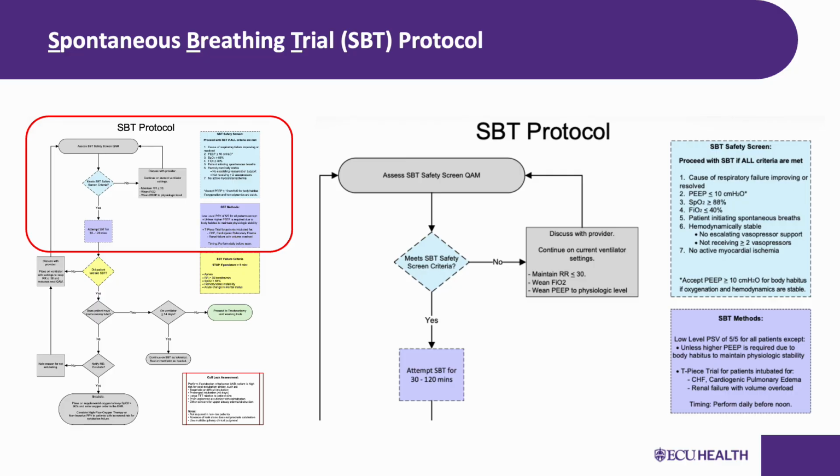The parameters emerged in the late 70s as an attempt to predict weaning readiness, but decades of research have shown us that they are poor positive predictors. The SBT replaced the approach with a direct functional assessment of the patient's ability to breathe independently. Bottom line, if a physician requests parameters, absolutely perform them. But our protocol does not require them because the evidence does not support their routine use as a gatekeeping step before extubation. The SBT is the test.